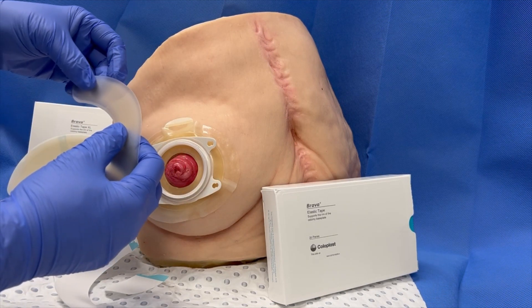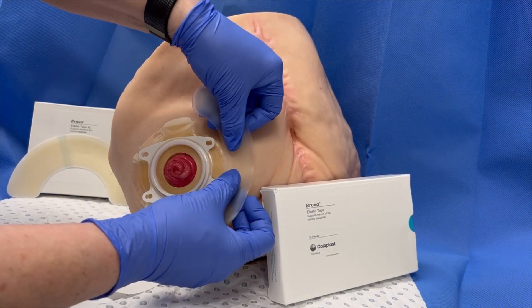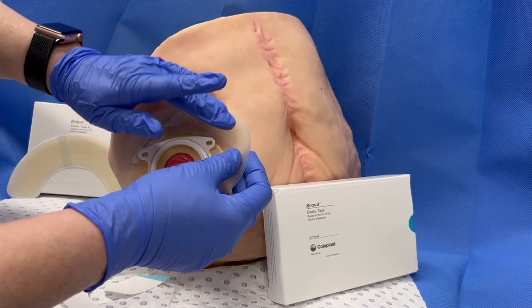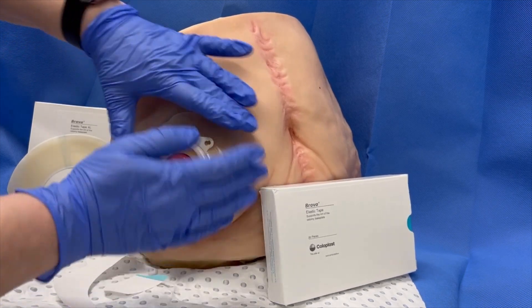Some people like to start at one end and move it around; some people like to start in the middle and then manipulate it around — whatever you prefer and find easiest to manage. I tend to start at the top and then just guide the tape around in place.